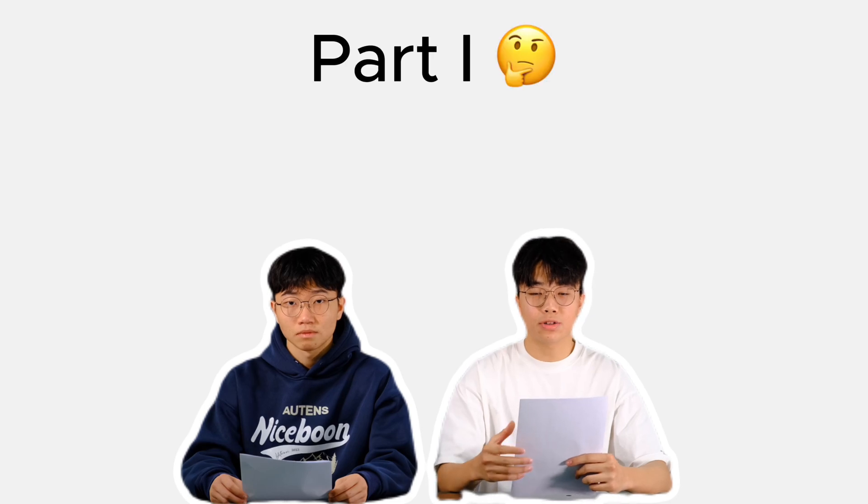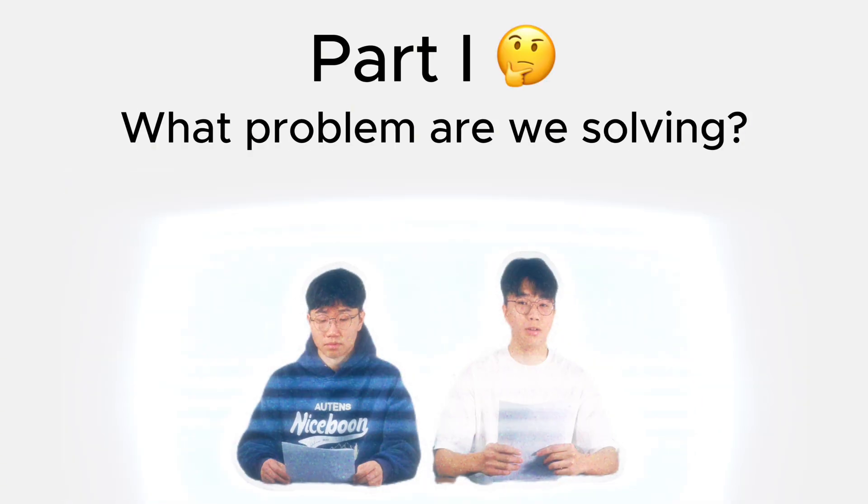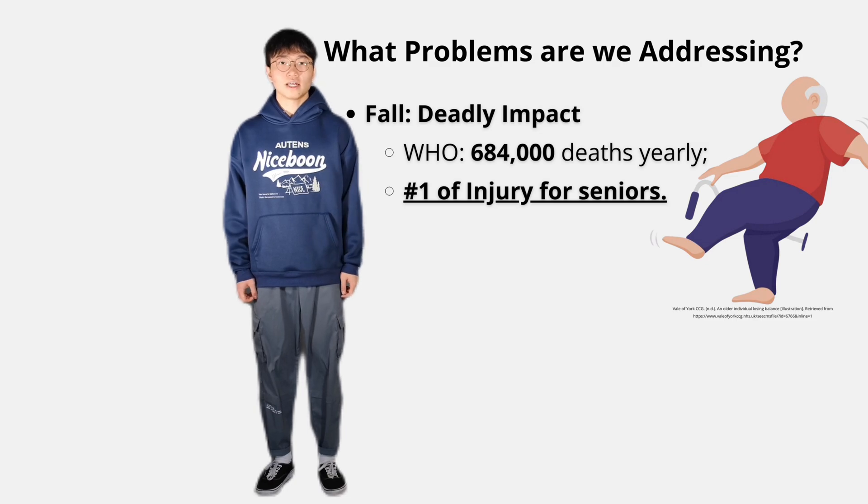Before we built a tail, we asked ourselves a simple question: what problem are we solving? The answer — falling. Yes, it sounds minor, but it can be deadly.